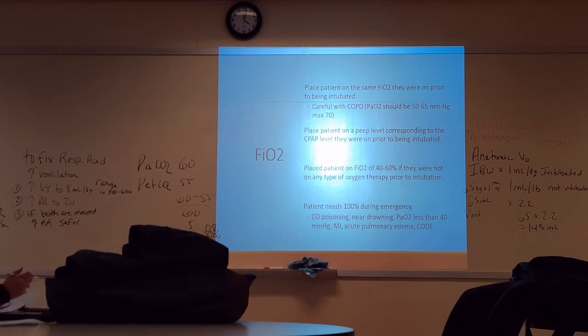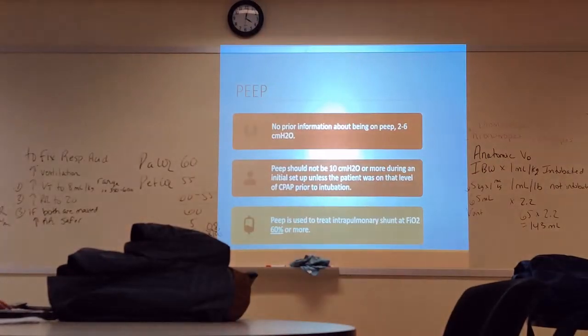We've talked about this before, but I wanted to tuck it back in here just so we could review it. PEEP can be anywhere between 2 and 6. You're going to see most of us in the hospital use 5 just because we're trying to get back to that normal physiologic PEEP. If we're going past 10, the boards consider that therapy. We're actually doing therapeutic PEEP, and you need to prove that somebody needs that much PEEP. So you're not just going to pull a PEEP of 10 out of space, unless Brian was already wearing my V60 back here, and I already had him at a CPAP of 10. If I already had him at a CPAP of 10, I have to match it when I intubate. Does that make sense? Otherwise go less.